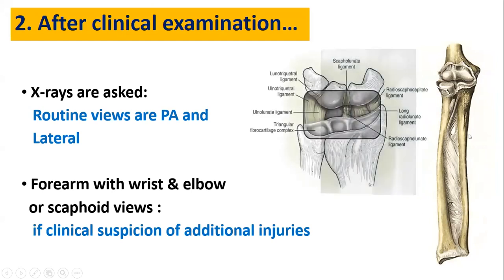It's very, very important, again, to look distally also into the radiocarpal area so that you don't miss any of these injuries. So not concentrate everything around the distal radius. You need to look all the areas distally to the side here and again proximally all the way up here. A lot of times injuries like these are missed.